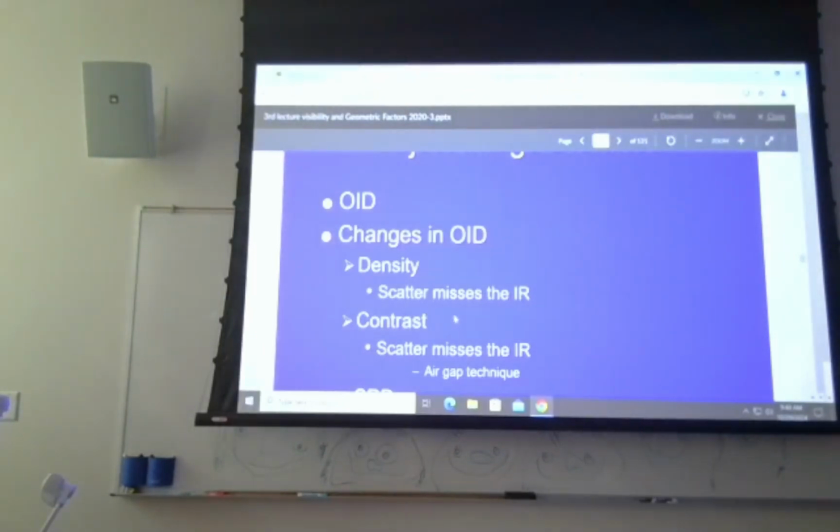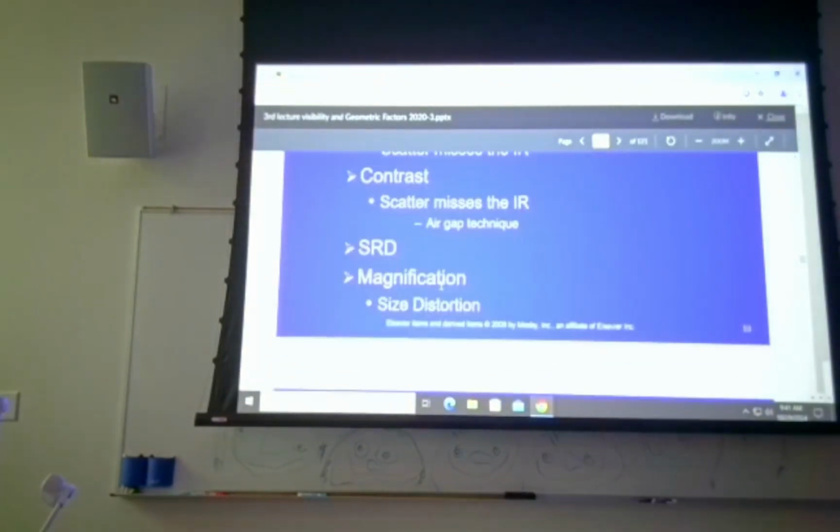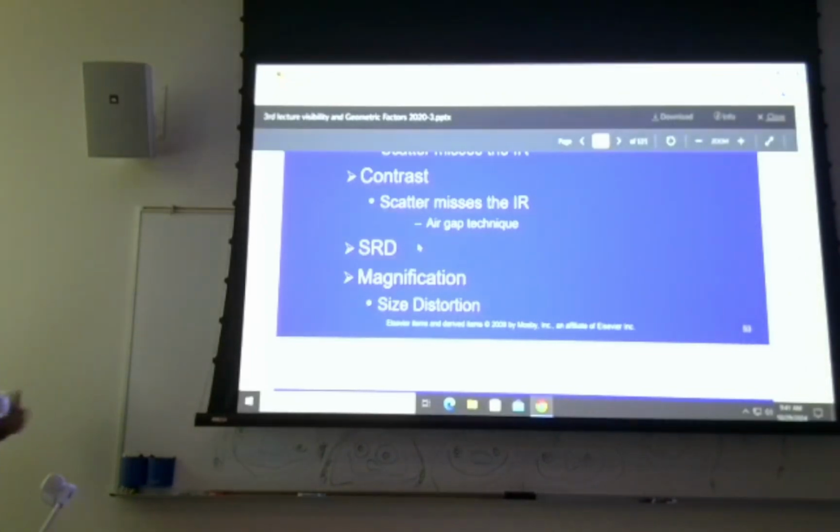The effects on contrast now just aren't going to be really any effects on contrast. You probably are not going to see all that much of a difference between the two. But you could certainly compare both of those, your image receptor exposure and possibly the contrast, by using the air gap versus using the actual grid, seeing which one gives you a better image. So the effects on sharpness, or recorded detail: the more you increase your OID, the more sharpness you're going to lose.